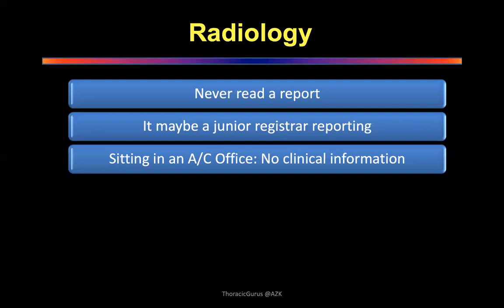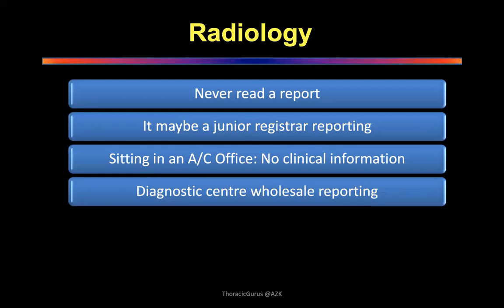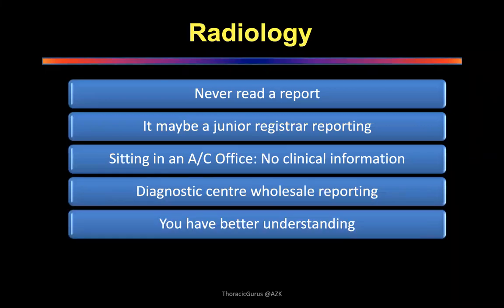So very, very, very important that when you are reading radiology films, when you're reading radiology x-rays, please do not read the report first. Absolutely vital. Okay, the last thing you want is to misinterpret or misunderstand a clinical situation.